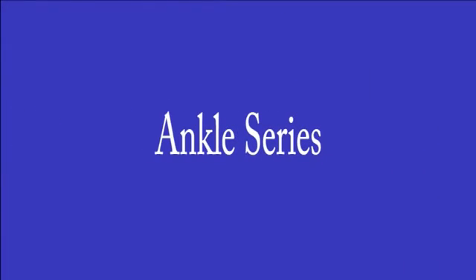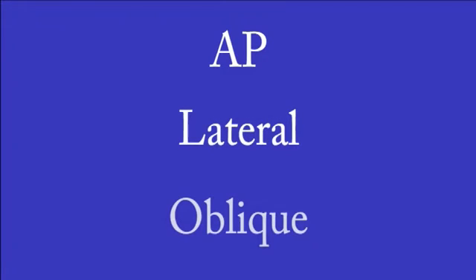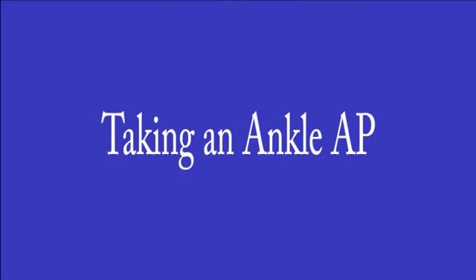Now that you've learned how to take a foot X-ray series, we will focus our attention on taking an ankle series. As with the foot, there are three views that you will take whenever you get an ankle series: the AP, lateral, and oblique. Unlike the foot series, however, you will set up the cassette the same way each time, and you will use one cassette per view. There is no need to partition off a side.